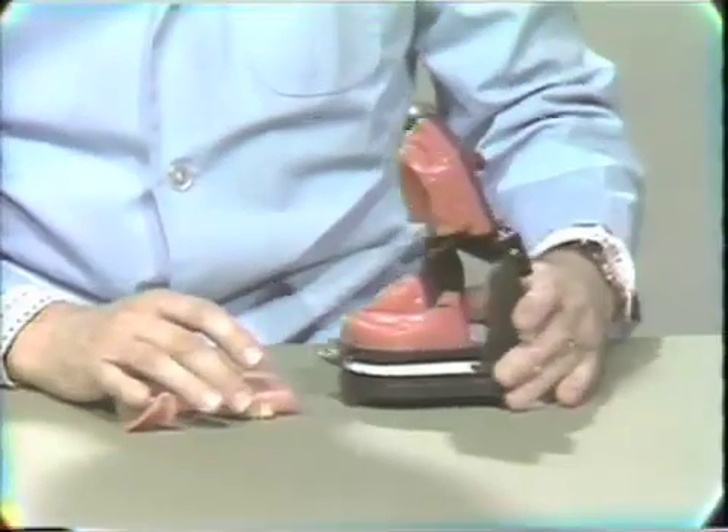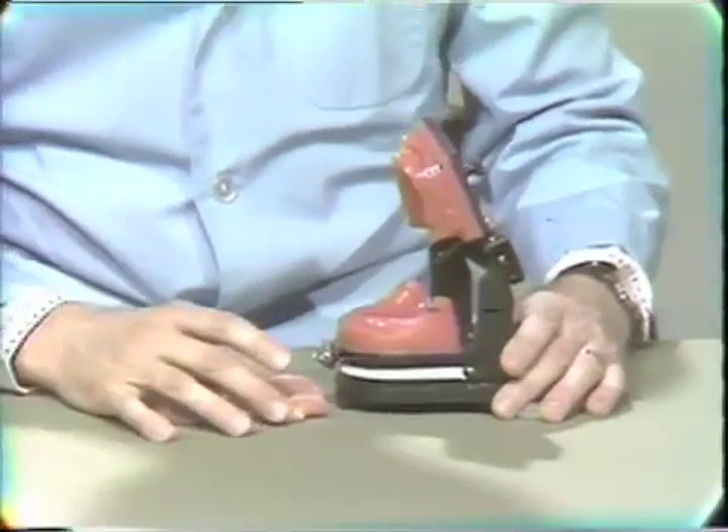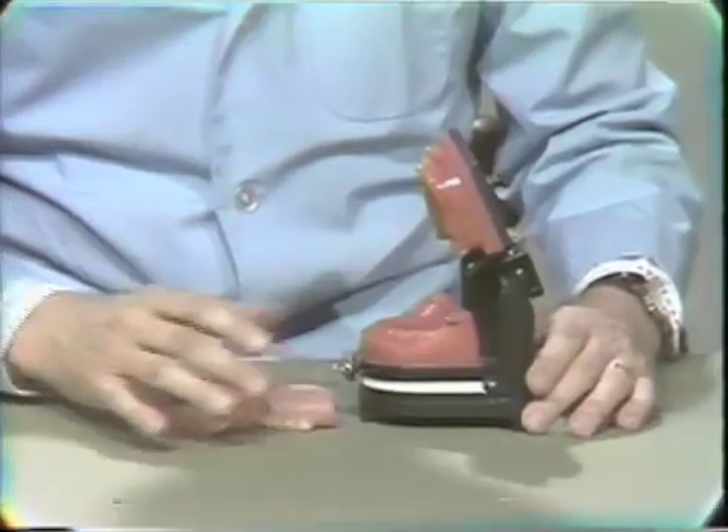Now, there are two methods of doing this, or even more than two methods. One is the method you will use in the clinic, which differs from the method that we will use in the laboratory.